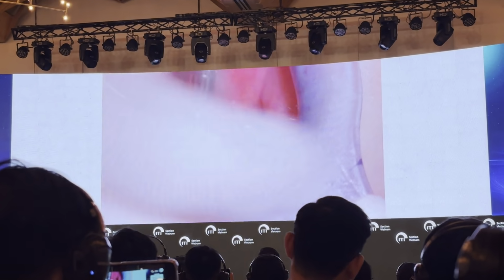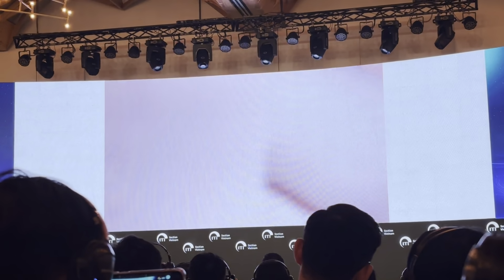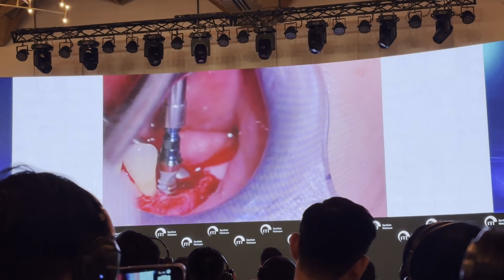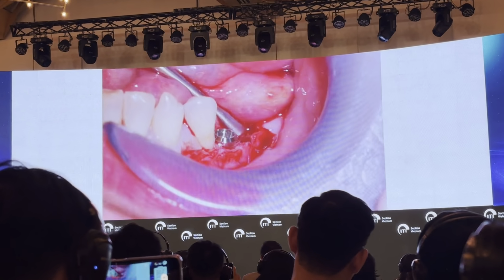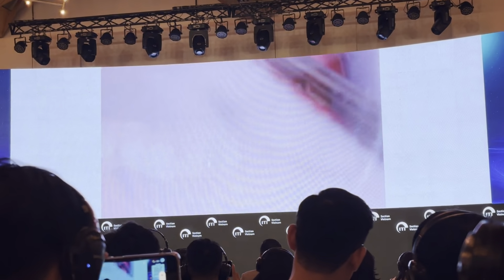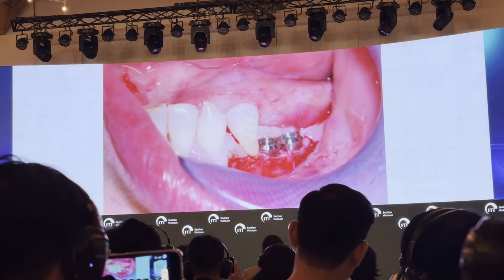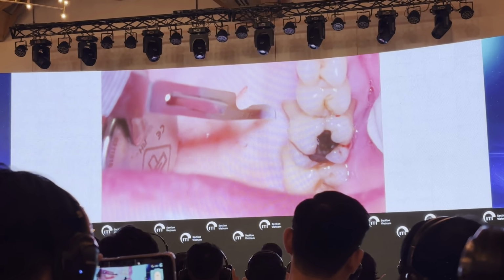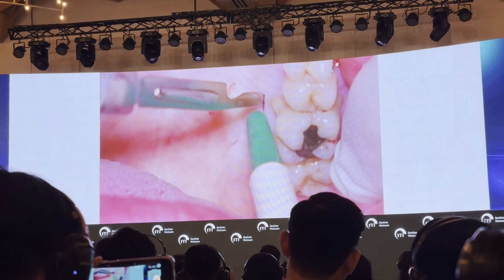So you can perform this simultaneous free gingival graft and implant placement only when you are sure of the presence of the entire buccal bone wall after implant placement. Because in case of buccal bone lesions, the graft is not going to survive, and the technique should be a bilaminar technique, as we will see in a while.